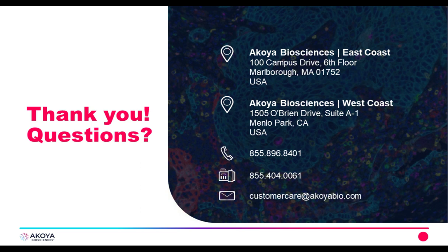When titrating the antibody, did you formally calculate a signal-to-noise ratio, or was this more qualitative? For the antibodies that we conjugated ourselves, it was more of a qualitative analysis. I'm not sure if Dr. Carlson can speak about the recommended titrations for the Akoya antibodies. Sure. We titrate the majority of our antibodies in our control tissues for our validated antibodies. There are some subsets of tissues that we titrate specifically for those tissues of interest. I'm happy to have a dialogue on how we do that separately after the webinar.